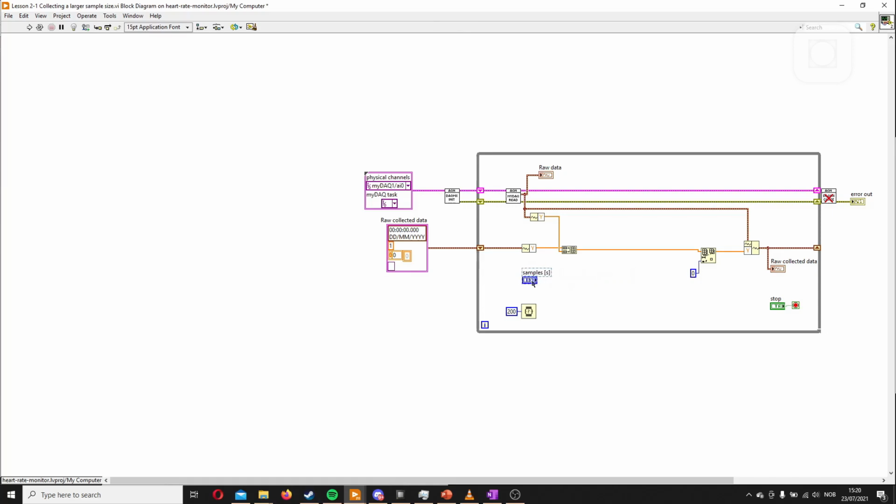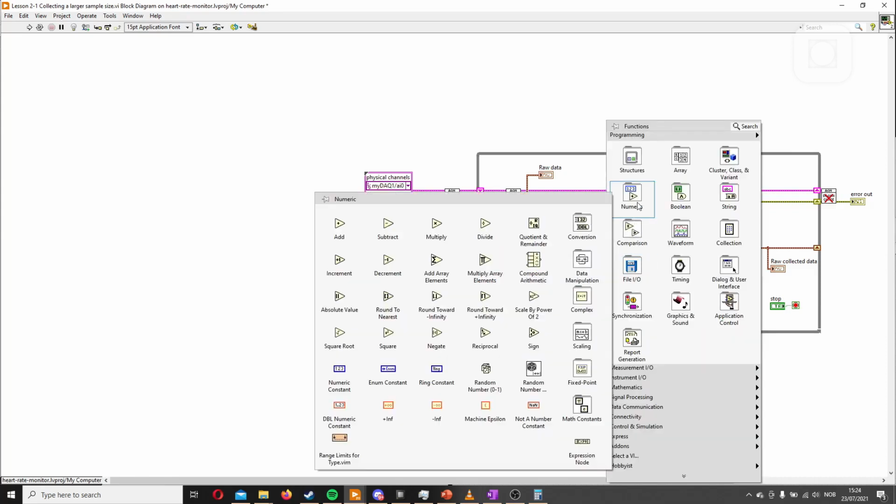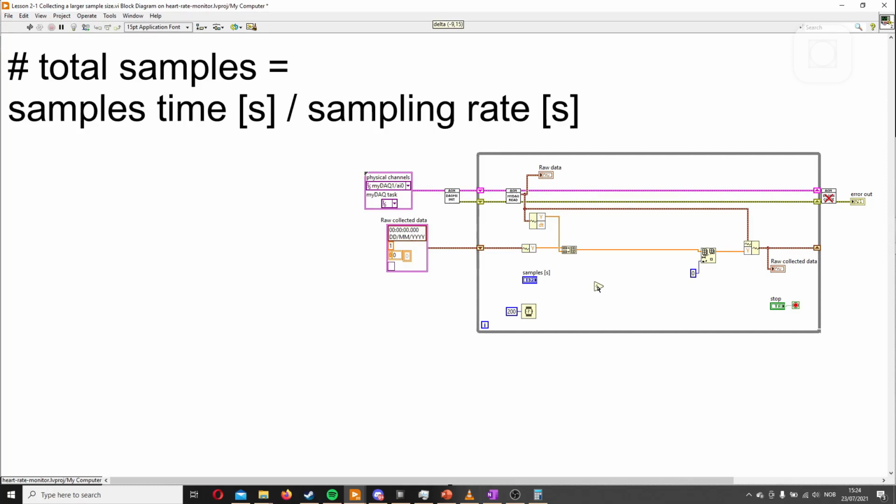And from this should choose the size. But how would we do that? To know how many samples we need to delete, we need to know how much time each sample takes, and that we get from the dt. What we want to do is to figure out how many samples there is in X amount of seconds. And to do this, we need to divide the sample in seconds we want with the delta t.